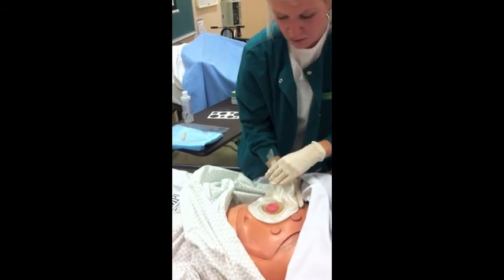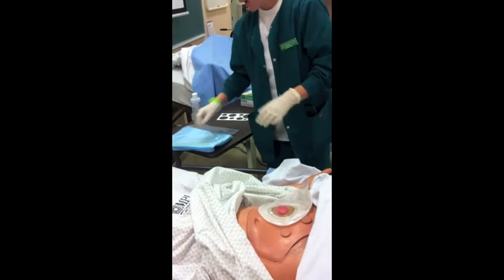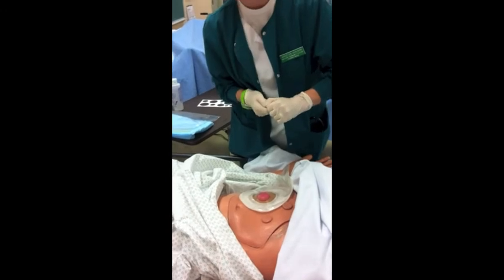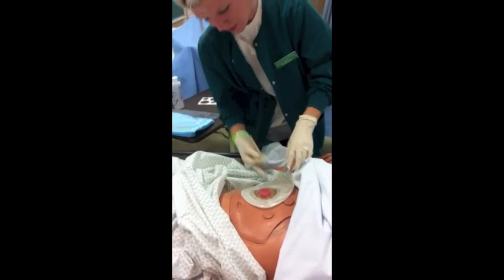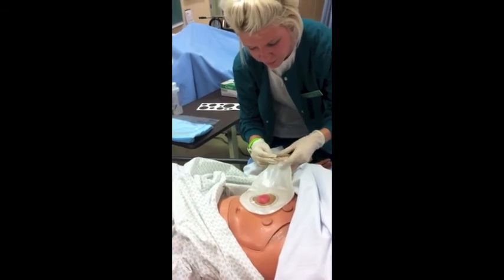The right documentation and the right response. And I'm now going to put the clip on the bottom of the bag. Everything's in place and fits well. On my second check, patient's still in no pain and is comfortable. I want to make sure that when I put the clip in, I'm flipping the lip of the bag upwards.